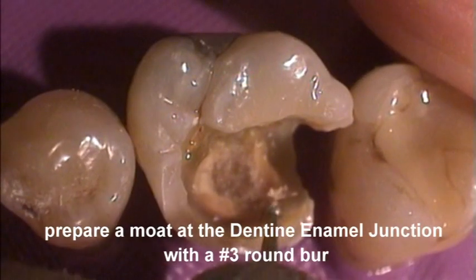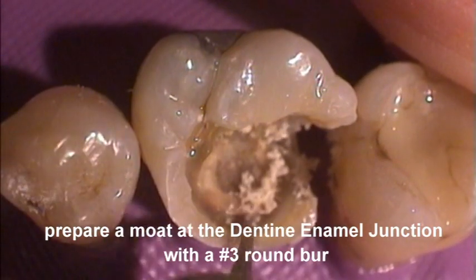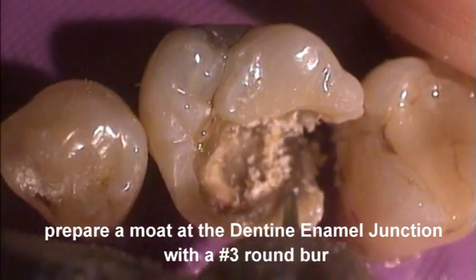Using a number three round slow speed burr, remove the caries dentine at the dento-enamel junction and cavity floor so as to encircle the caries with sound dentine.